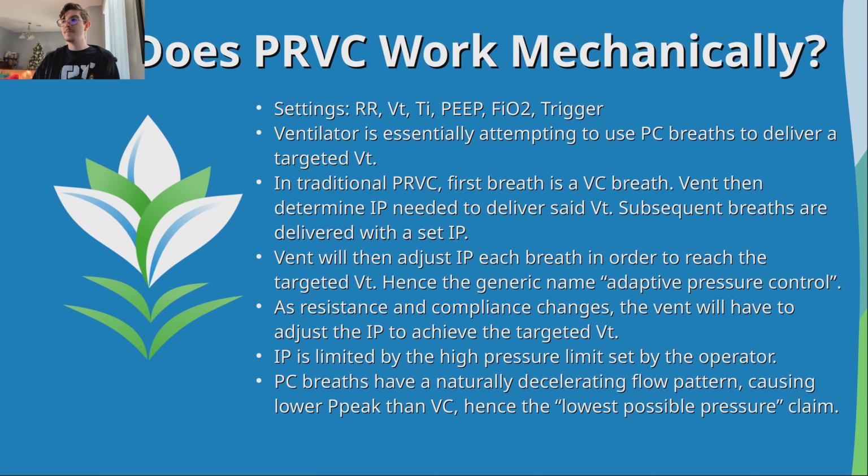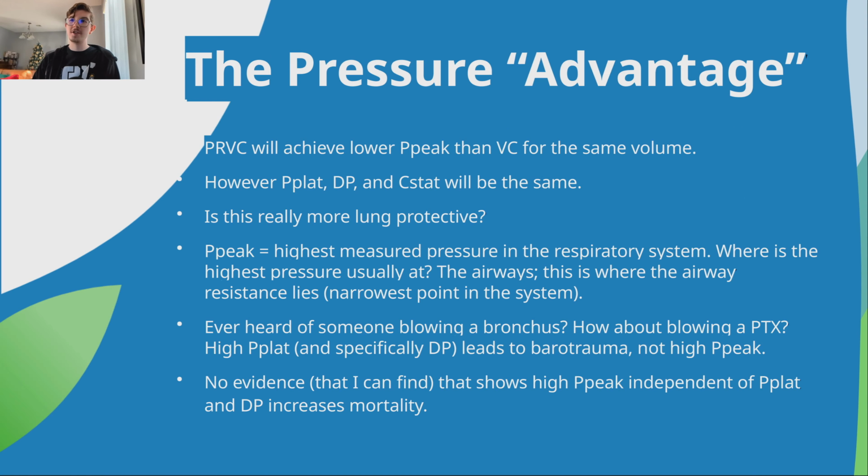That's where that claim is coming from. And it's technically not wrong, but they mean lowest possible peak pressure. So pressure advantage, this is what I'm talking about. PRVC will achieve lower peak pressures than volume control for the same volume. However, your plateau pressure, your driving pressure, your static compliance will all be the same as in volume control. So here's the question. Is that really more lung protective?